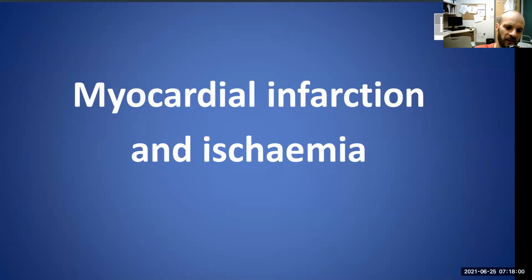So myocardial infarction and ischemia. Okay, so let's have a little look at this stuff. This topic really relates quite nicely to the previous one of heart rhythms, because myocardial infarction is a really common cause of abnormal heart rhythms.